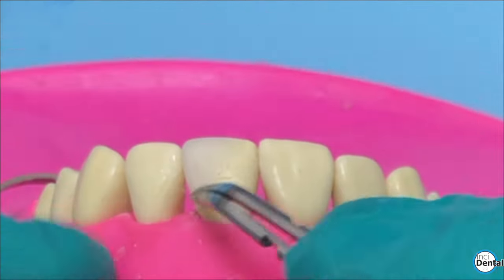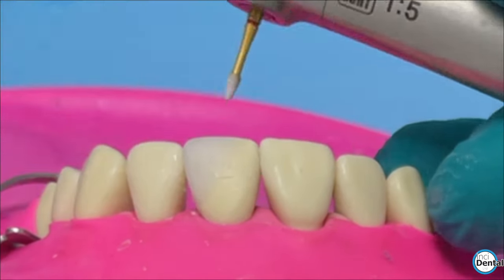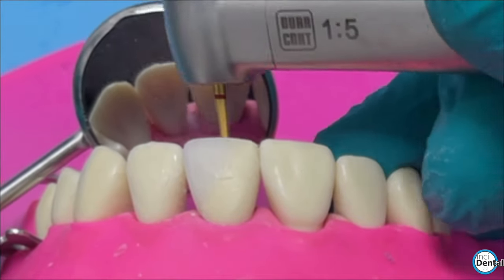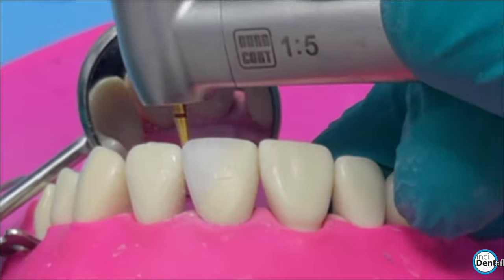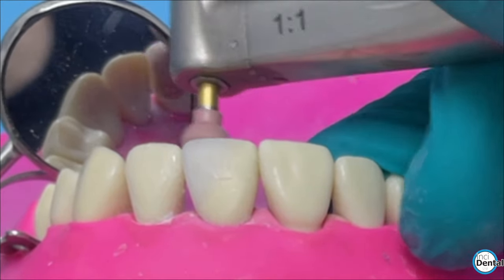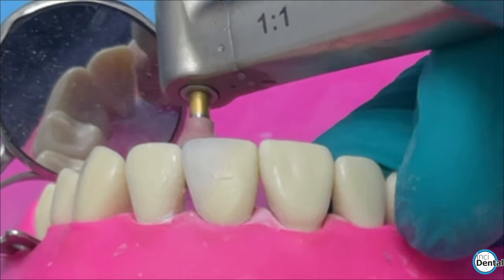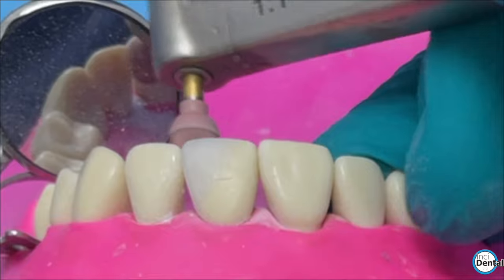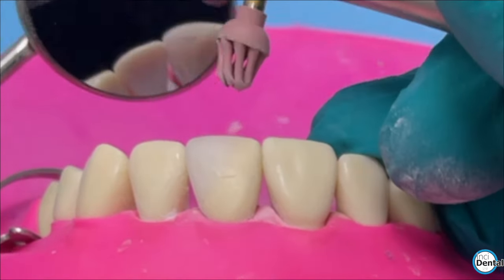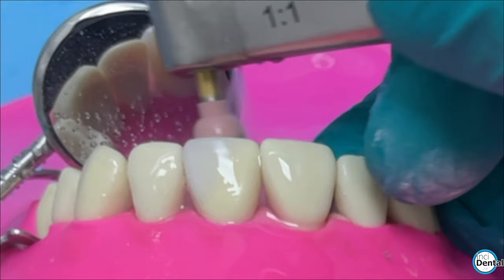Now we focus on the palatal surface. My favourite bur for this is the little torpedo — I occasionally use the rugby ball but the torpedo is generally best — and I'm just going to blend carefully across from the composite onto the tooth. I do this with the water off, using very light pressure. Then comes my desert island disc of polishers: the medium grip Ocloflex from EVE. It's just perfect for palatal surfaces. You can use it dry, but limit speed to about 8,000 RPM and use light pressure so it lasts longer. What I really love is that you can also use it with the water on — I find it even more effective that way.